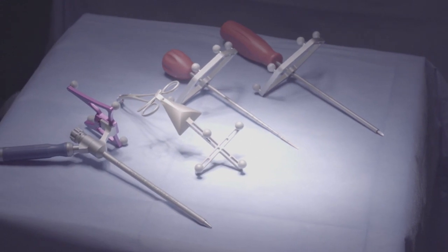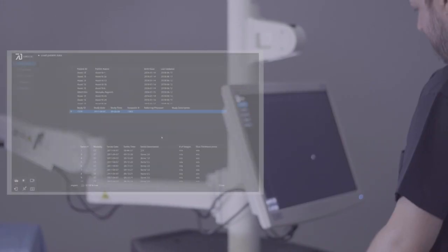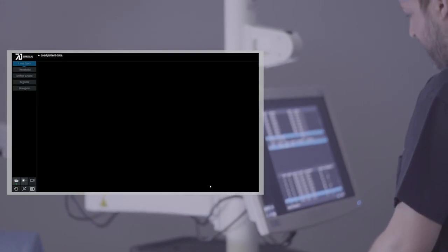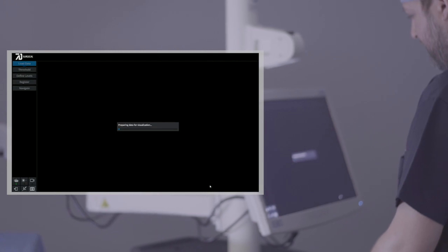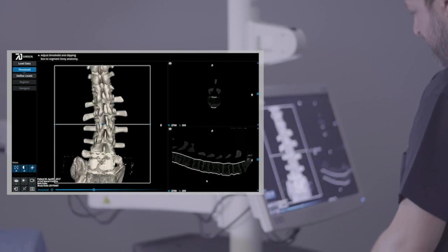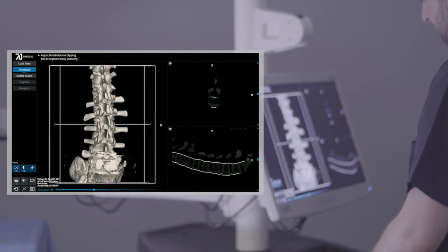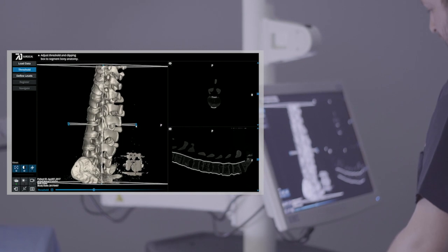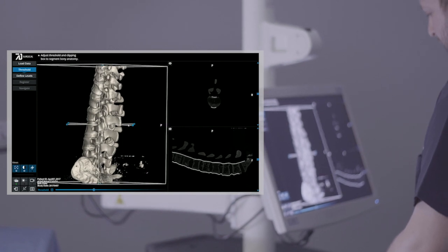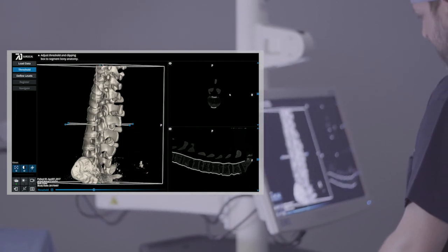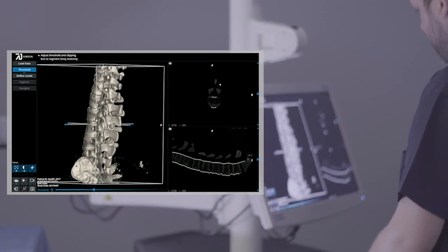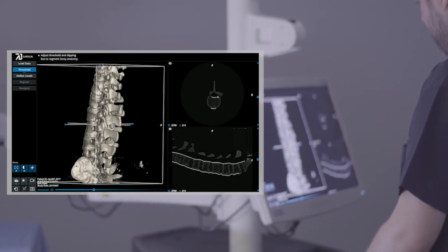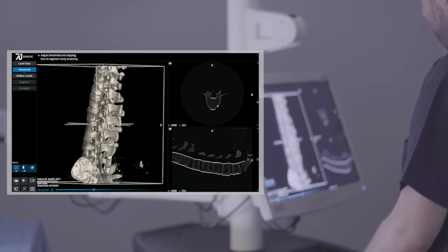Now the complete workflow. A 7D protocol pre-operative CT dataset is loaded into the system via CD-ROM, USB, or PACS import. Once imported, the CT may be thresholded, cropped, and windowed. A slice-by-slice review of the anatomy is also possible.